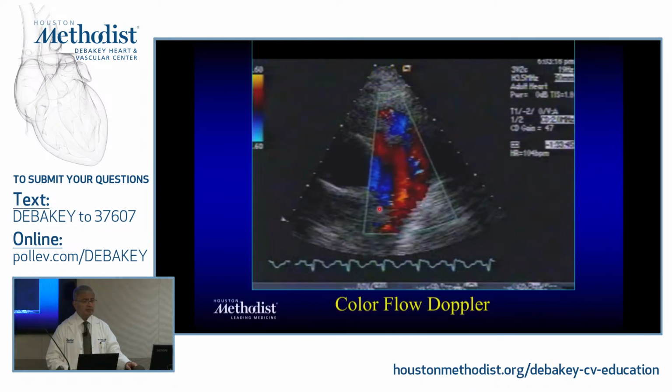Color Doppler is actually a form of pulse Doppler, and it has small gates. You could see them there; they're just depicted basically. The convention is that if it is going away from you, it's in the blue shades. If it is coming towards you, it's in the red or yellow shades.